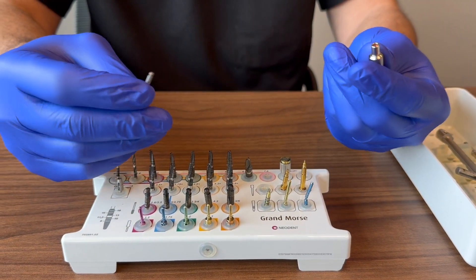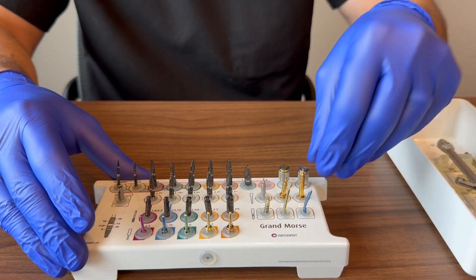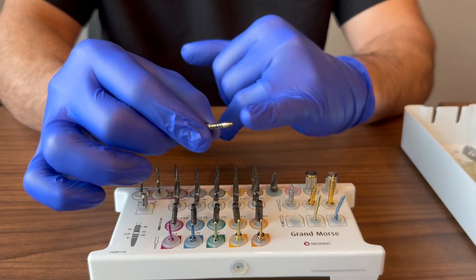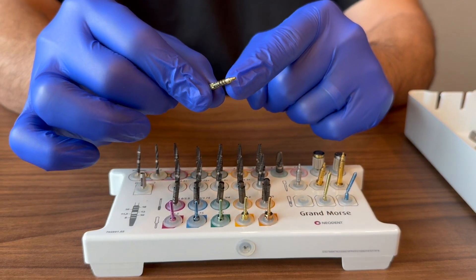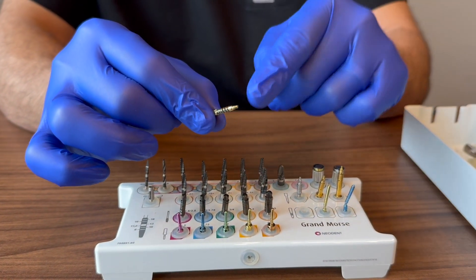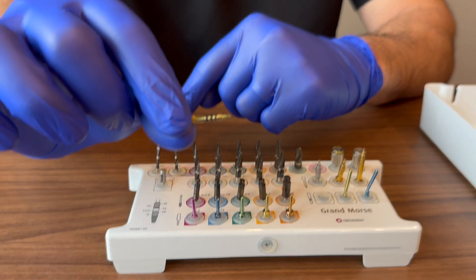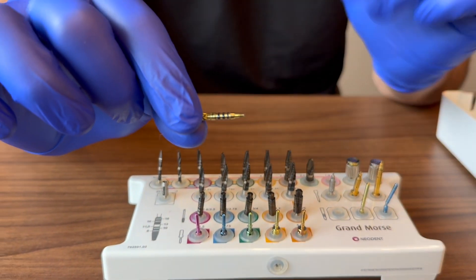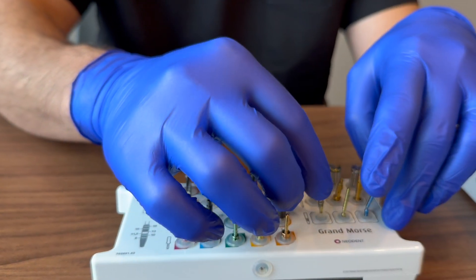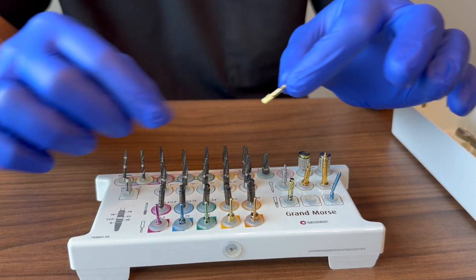Another instrument screws into the head of the implant so you can take an X-ray to see how deep you are below the bone level. The black markings on it are radiopaque, so they show up on your X-ray with millimeter markings. Generally speaking, it doesn't see much use, but it's there as an option.